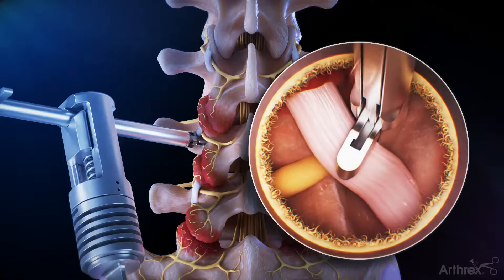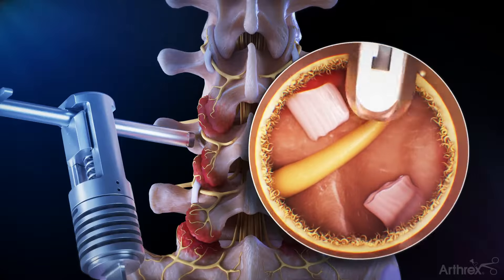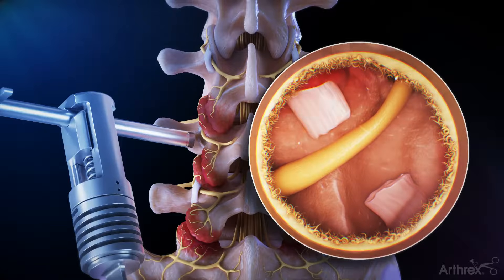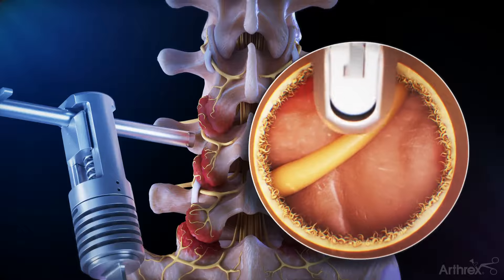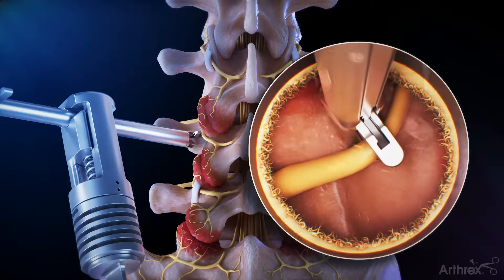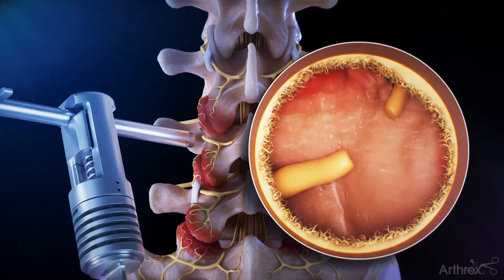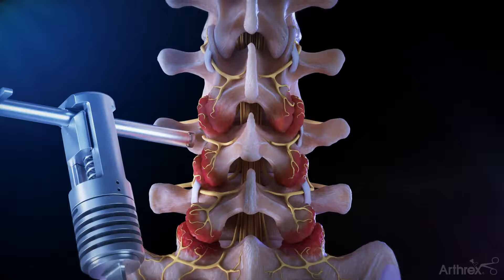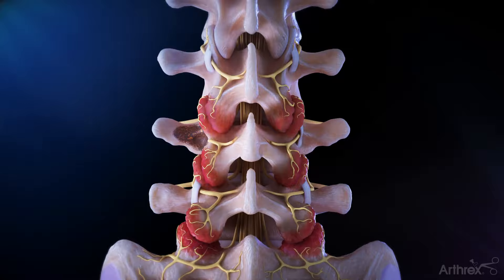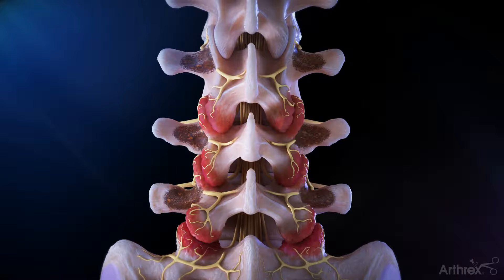Once your surgeon has reached the medial branch nerve, they will remove any surrounding tissue and then cut the nerve using a pair of micro-scissors. The ends of the nerve and surrounding tissue are then cauterized using a special electrosurgery instrument to help decrease bleeding and minimize post-operative pain.